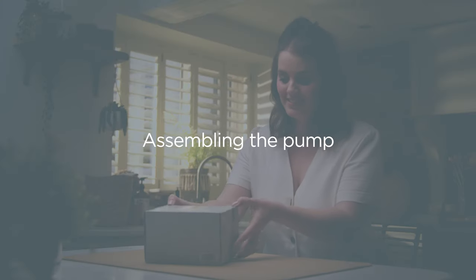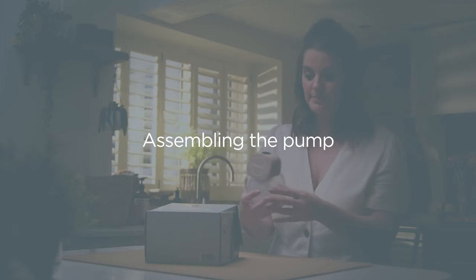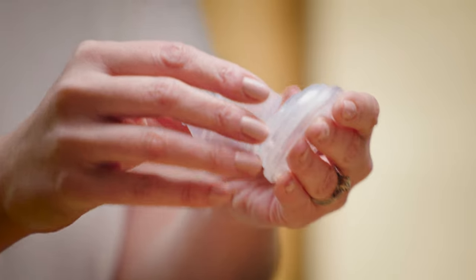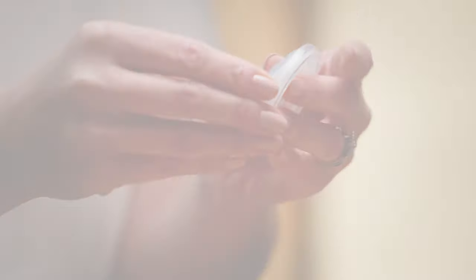When the pump is charged and the components are dry, the pump can be assembled in a few clicks. When assembling the pump, it's vital that it's done correctly as this is key to its performance. The Pupetta Pump is made up of six parts.